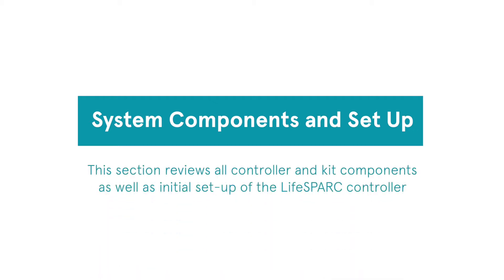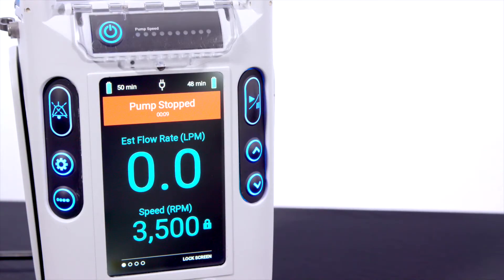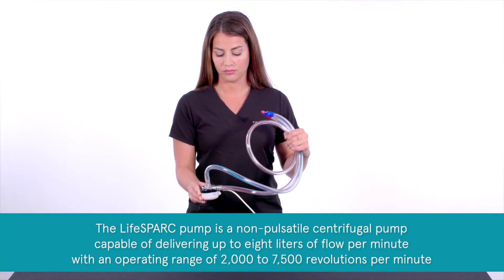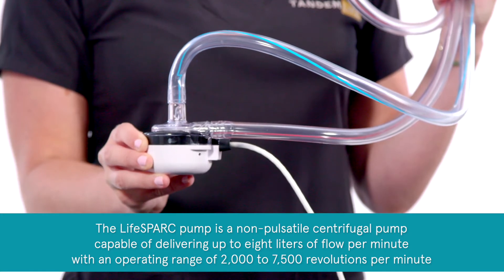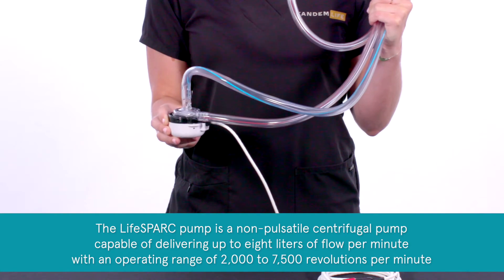Module 1 – System Components and Setup. This section reviews all controller and kit components as well as initial setup of the LifeSpark controller. The LifeSpark system is comprised of a reusable controller and a sterile single-use pump. The LifeSpark pump is a non-pulsatile centrifugal pump capable of delivering up to 8 liters of flow per minute with an operating range of 2000 to 7500 revolutions per minute.